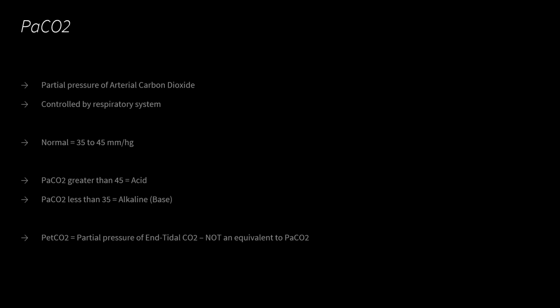You can also see this if you have poor ventilation. So if you have really tight bronchospastic lungs where you're not getting to read end alveolar gas, you will get a false low reading, even though the patient's arterial carbon dioxide level is actually quite high. You may actually not be able to sample that, especially if you're using a non-invasive sampling device. So there's just a couple caveats. The end-tidal CO2 can often be lower than the patient's actual arterial carbon dioxide. The opposite cannot happen. You cannot have a higher end-tidal CO2 than PaCO2, unless it's some sort of mechanical issue or something.